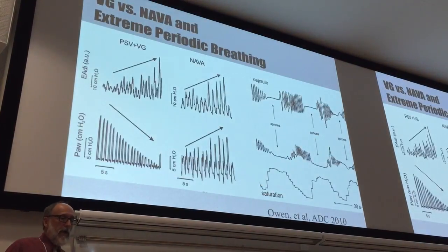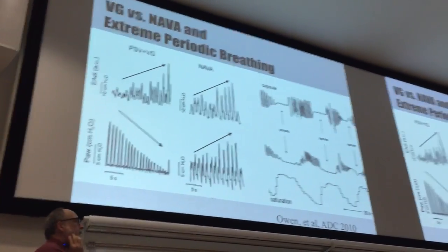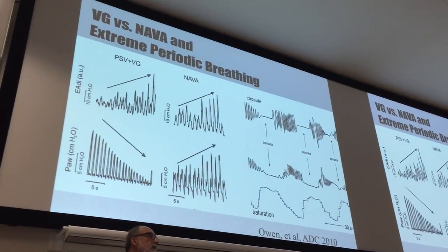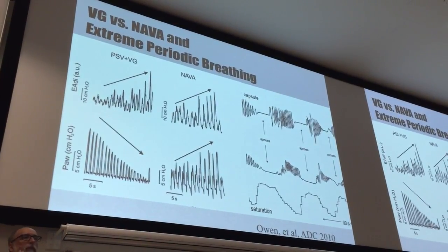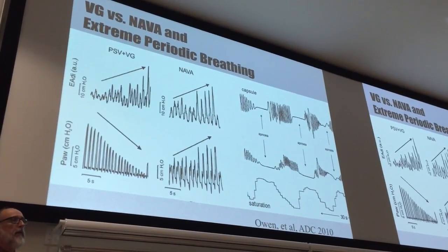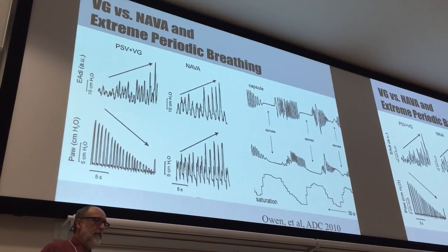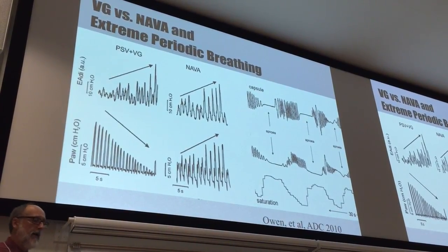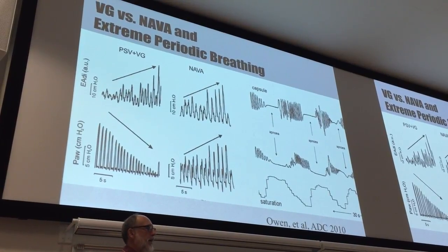So what about some of the other aspects? I love NAVA in full-term babies, probably older children. I love non-invasive NAVA. I love the trigger. Howard explained very nicely how much better triggering by diaphragm activity is than by flow or any other method. I love the ability to monitor the respiratory effort that the baby has.